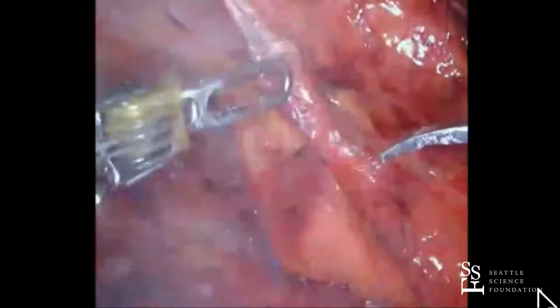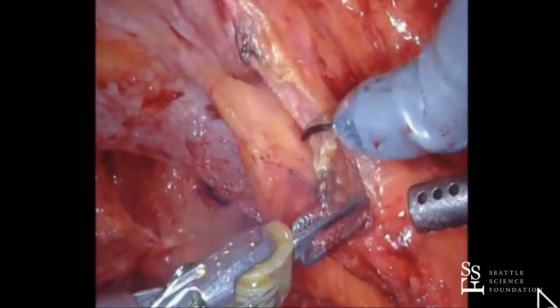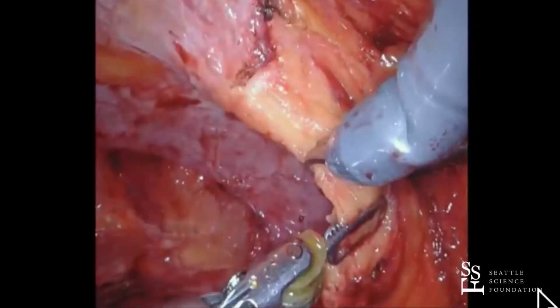Hold on, Brando. All right. So we're going to have to push the posterior arm back in. We're out a little bit. I'm having a little resistance, so that means that we're probably too far out with that arm.